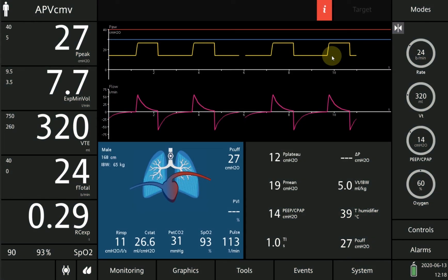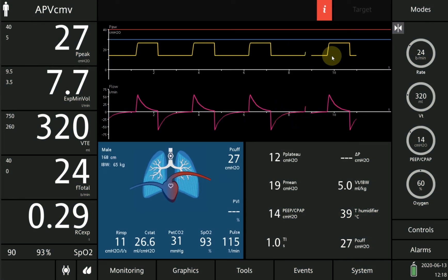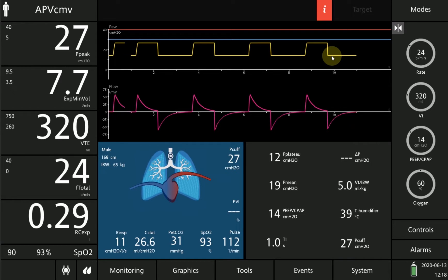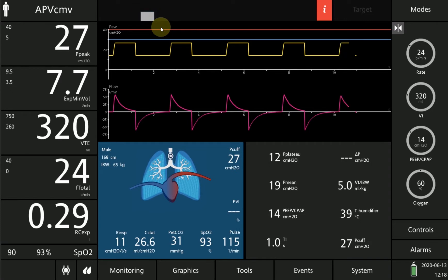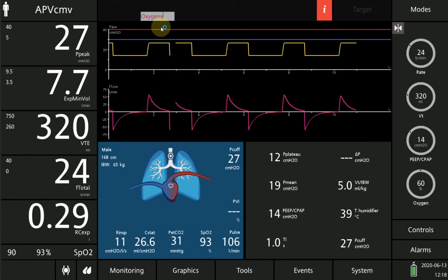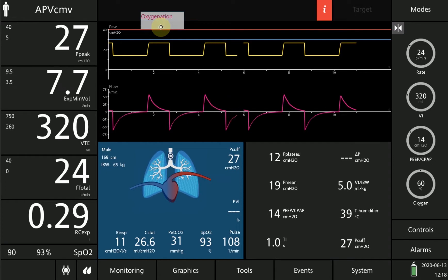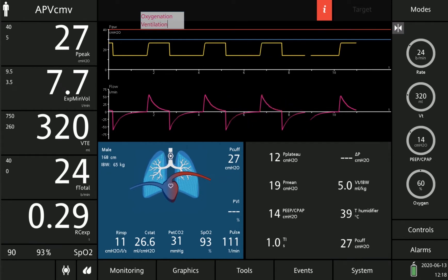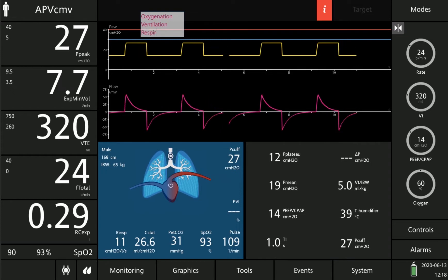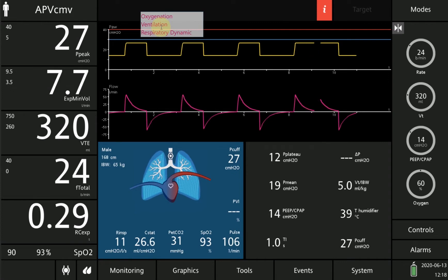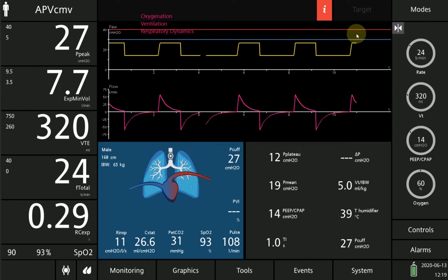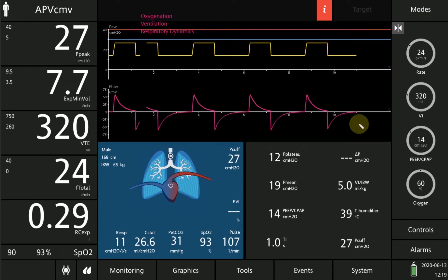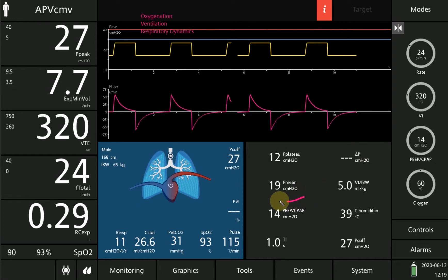Our patient has moderate ARDS and we are going to assess his respiratory status based on this ventilator screen. There are three components in the assessment of respiratory status: the first one is oxygenation, the second one is ventilation, and the third is respiratory dynamics.